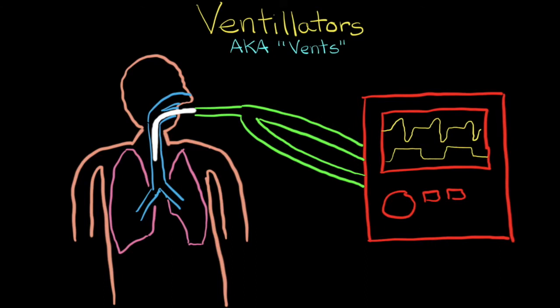So before moving on and talking about the different modes that you often will see, there is one key point that I want to stress with the ventilator support, and that is a ventilator is doing absolutely nothing to fix your patient. So let me say that again. A ventilator is doing absolutely nothing to fix your patient.